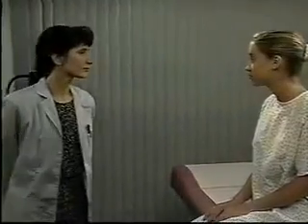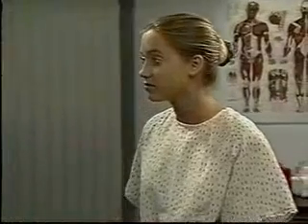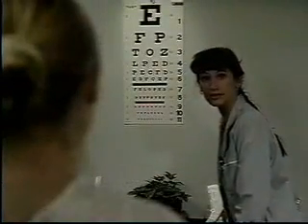This video presents examination of the head, including inspection of the head, hair, scalp, skull, and face, examination of the eyes, including tests for visual acuity and visual fields, inspection of the eyes, and ophthalmoscopic examination, and examination of the ears, including inspection of the ears, otoscopic examination, and tests for hearing.